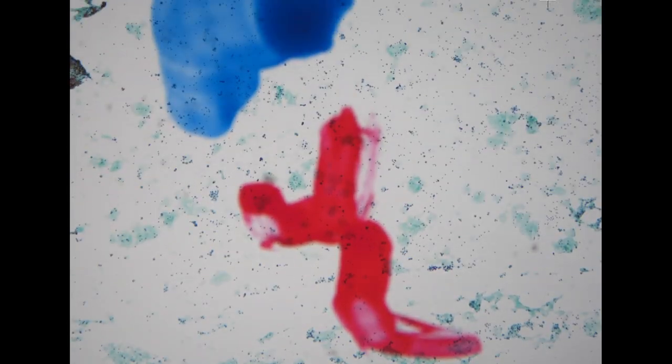So the first specimen is from a 73-year-old female who is a past smoker. This is her pleural effusion specimen. This is one of the cases that I would want every resident who graduates to be able to recognize.